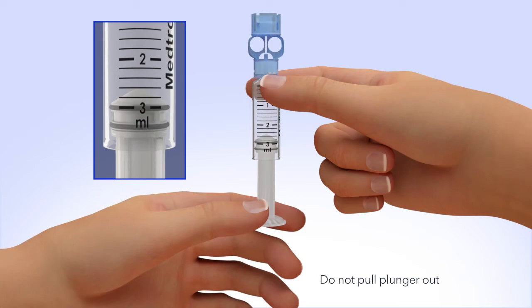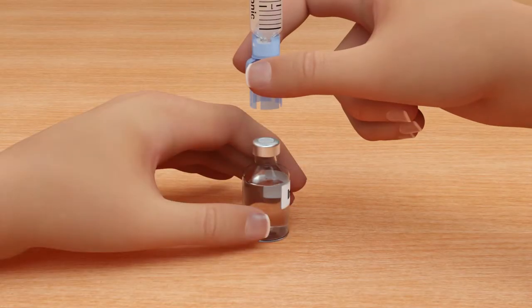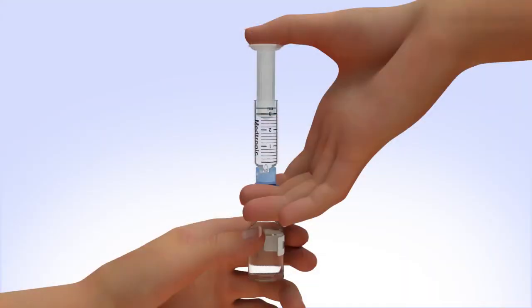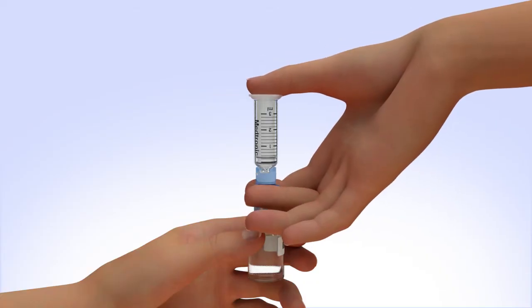Be careful not to pull the plunger completely out. Hold the reservoir by the blue transfer guard and connect it to the insulin vial by pressing down. Do not push down on the plunger during this step. Keep the insulin vial upright, place your thumb on the plunger, and firmly push the air from the reservoir into the insulin vial.